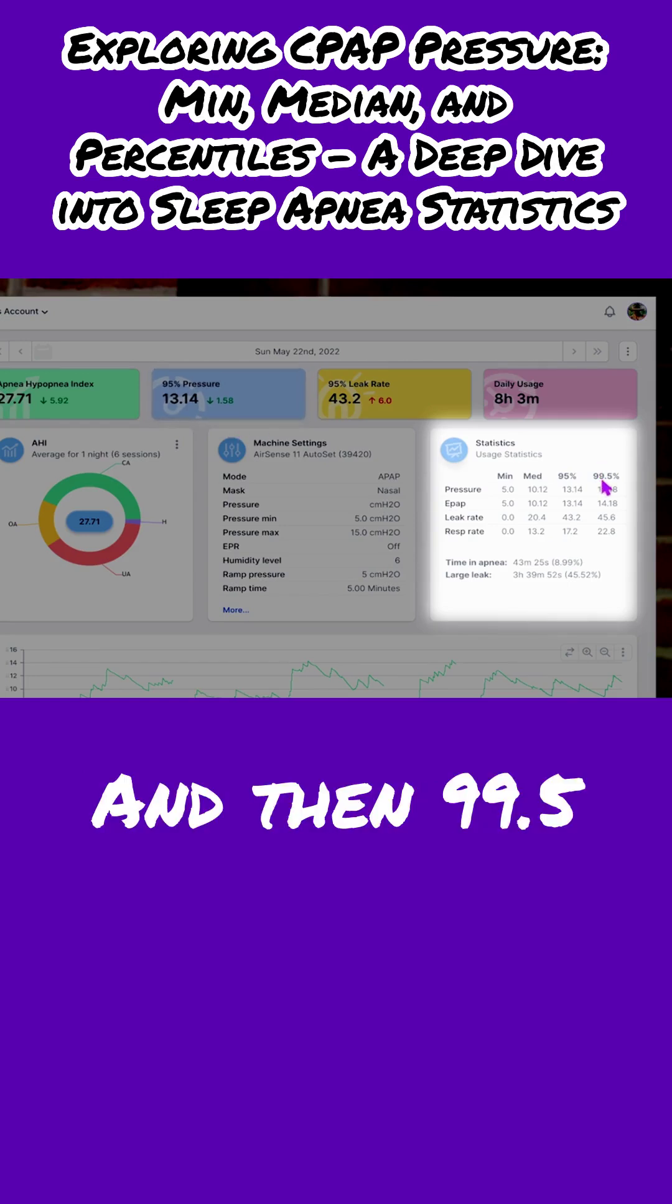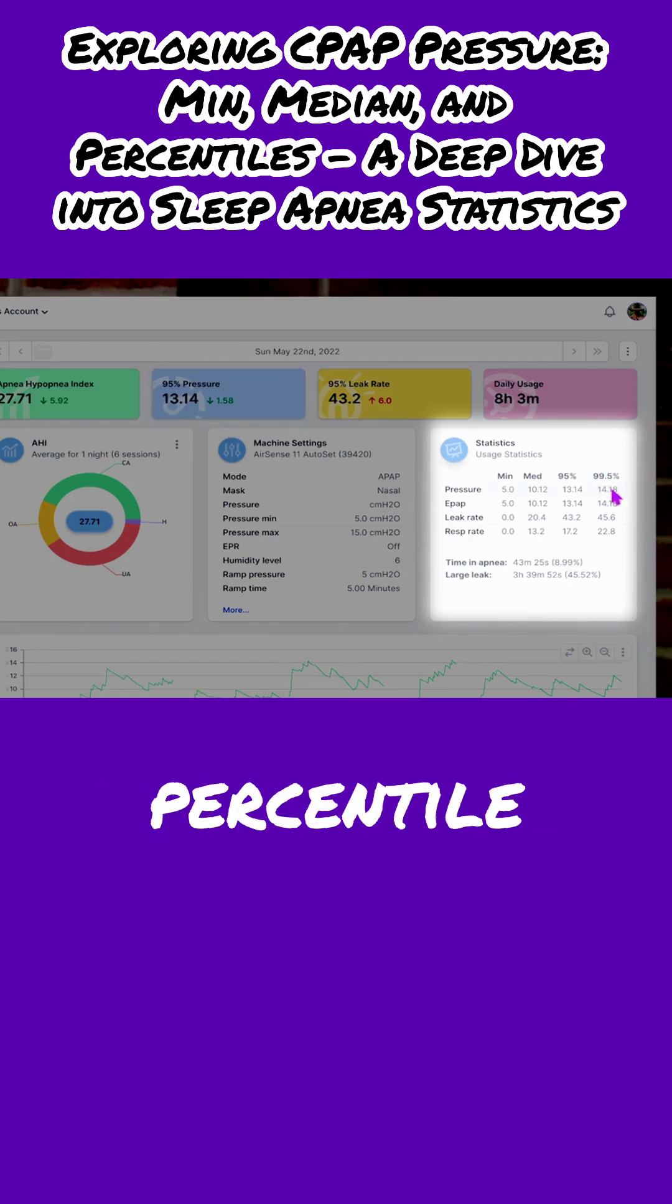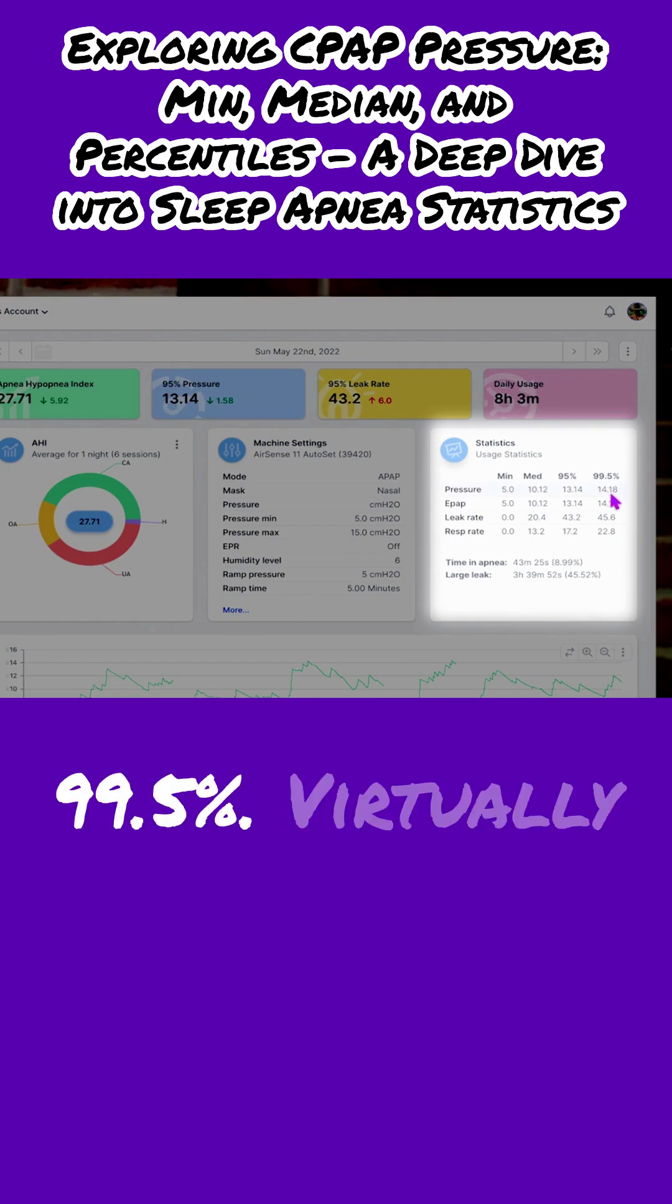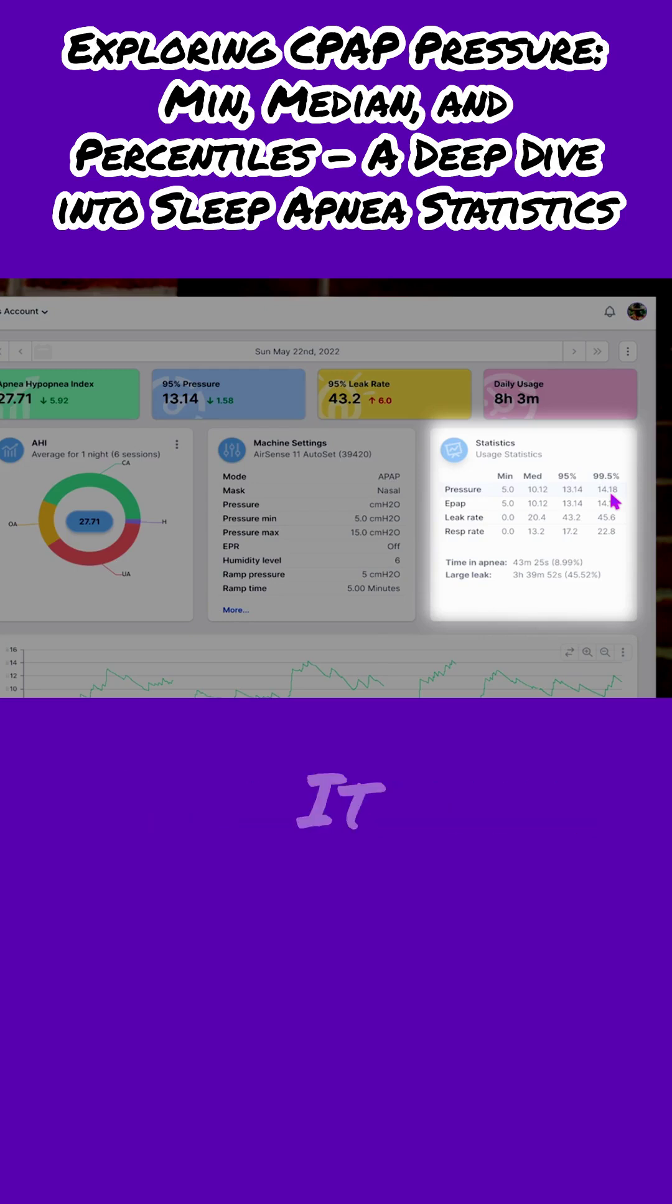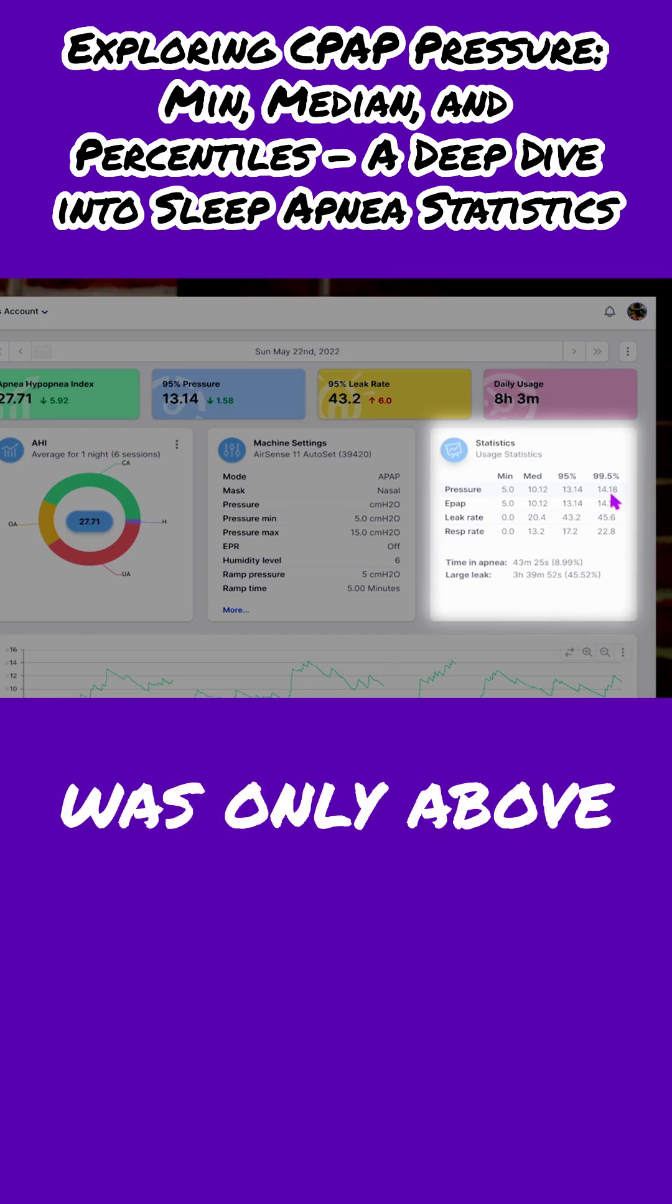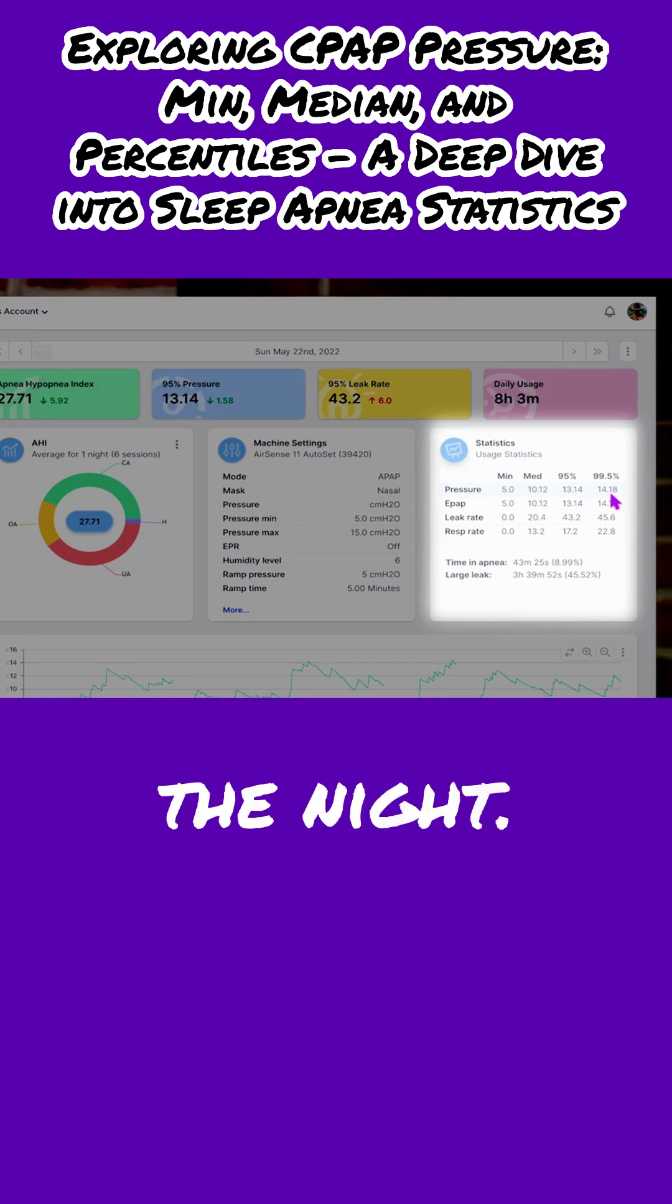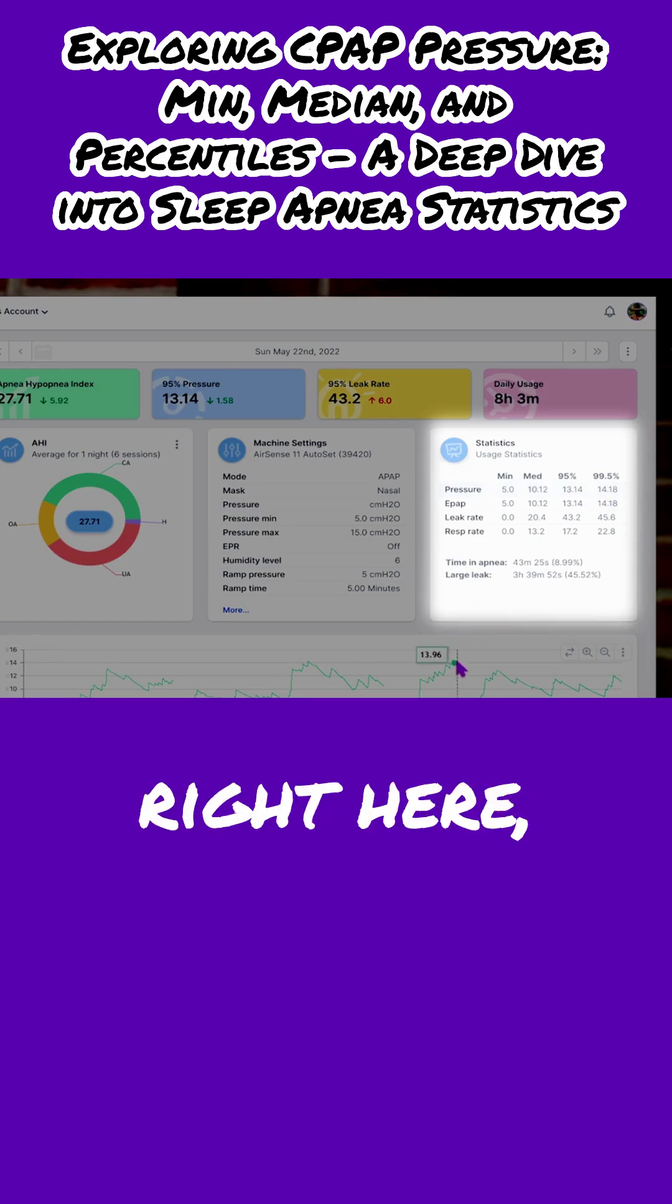And then 99.5 percentile pressure, 14.18. So that is 99.5%, virtually all the night. It was only above 14.18 for 0.5% of the night. This little part right here.